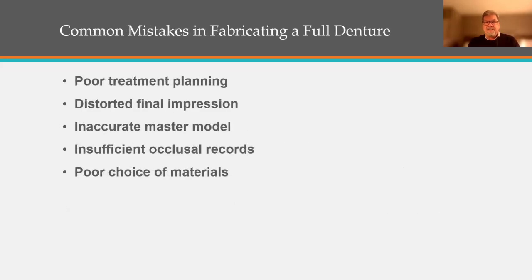Some of the common mistakes are poor treatment planning, distorted final impressions, inaccurate master models, insufficient occlusal records, and the poor choice of materials. I don't want to mention which group it was, but I had a large DSO group contact me saying one of the most difficult things the doctors are having is getting sufficient occlusal records in the operatory. So I did some education for them, and they were missing a lot of the vital things that they were supposed to be doing in capturing all the information for a successful denture.